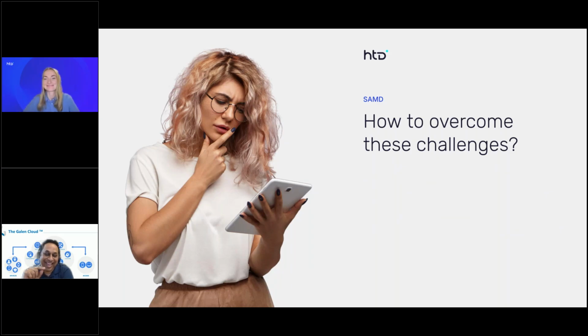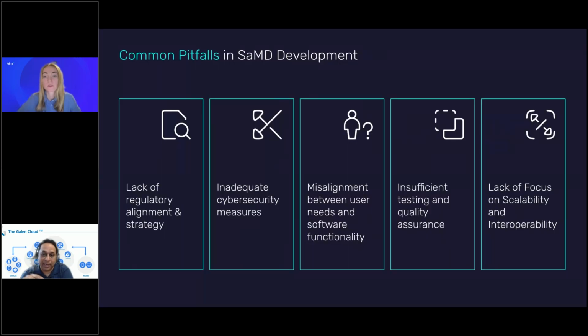Yeah, the cybersecurity one specifically is now a requirement for the FDA. They specifically say it needs to be a life cycle approach that you can no longer just do at the end, because they do want a full secure product lifecycle development. That's the word they use in their guidance. But again, I agree with that. These are some of the common pitfalls that we also see in projects we worked on.